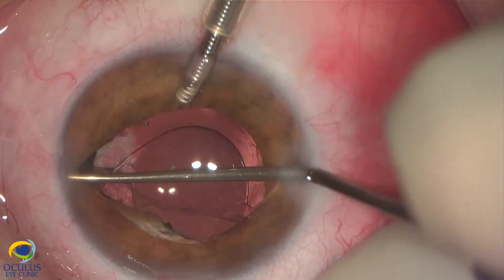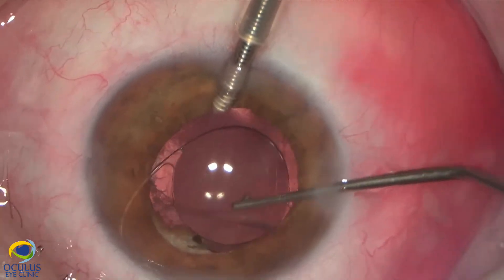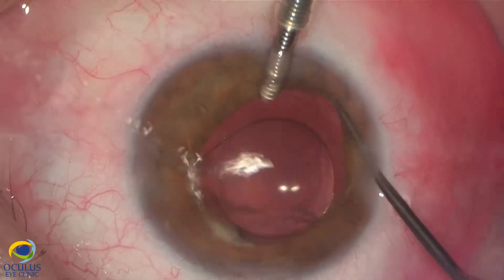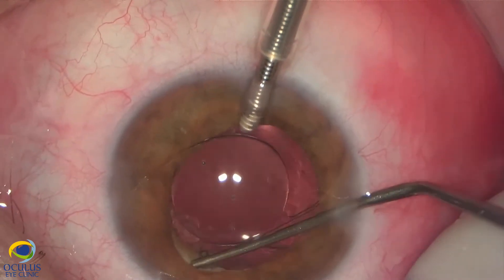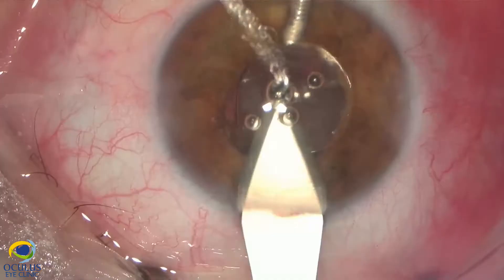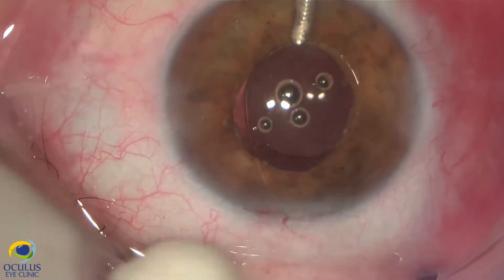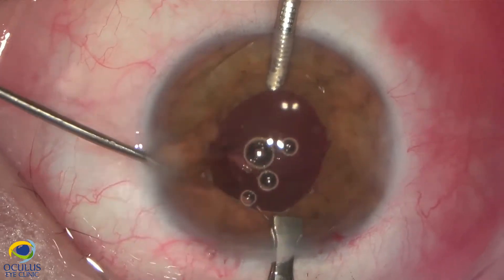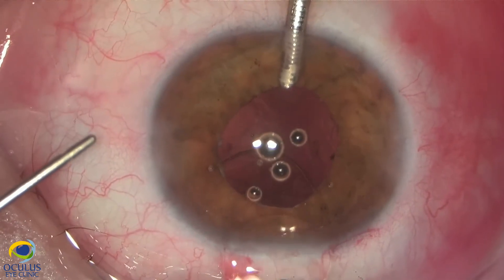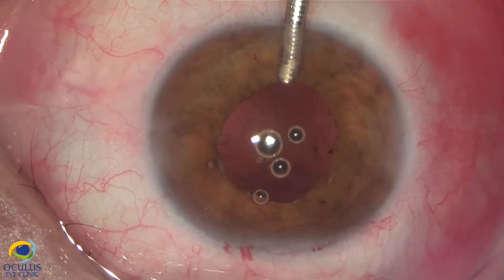We checked very carefully the periphery and noticed a peripheral rim of anterior and posterior capsule stuck together. We also noticed that this IOL was small in size — 5 mm optic part and only 12 mm in length. So we decided to explant it.